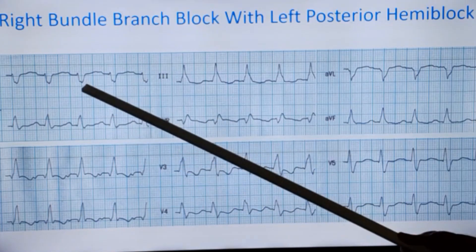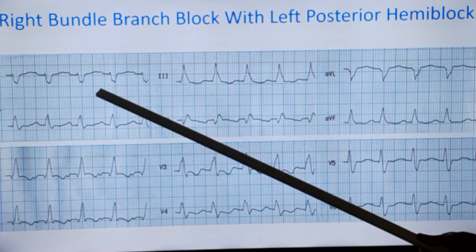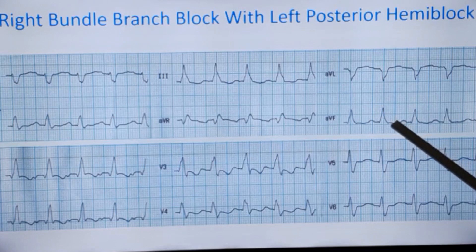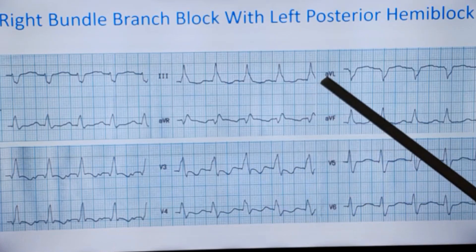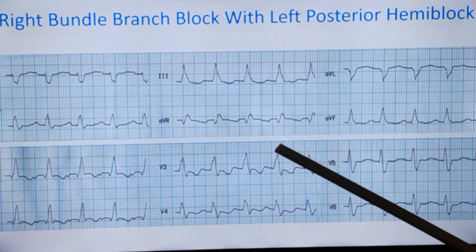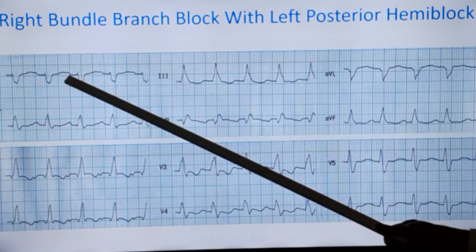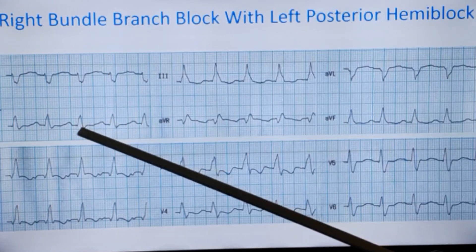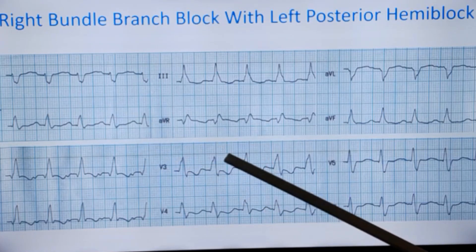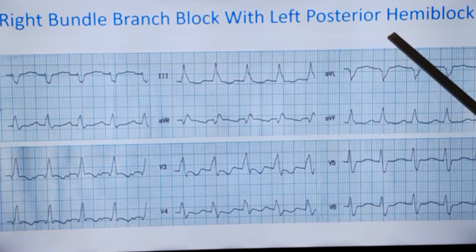These features — that is right axis deviation — negative complexes in lead 1 with positive complexes in AVF give you right axis deviation, as seen here. That is also a feature of left posterior hemiblock: right axis deviation. In addition, we are seeing the small R, deep S complexes in lateral leads and small Q, tall R pattern in inferior leads. These are all features of left posterior hemiblock.